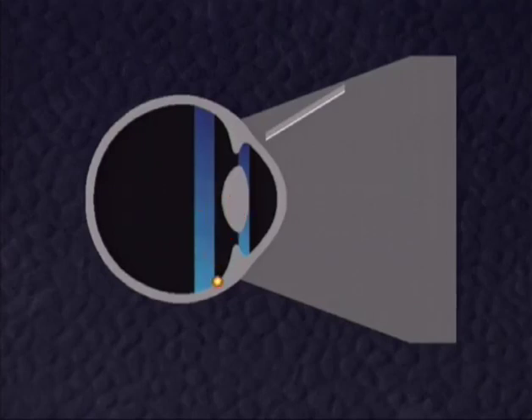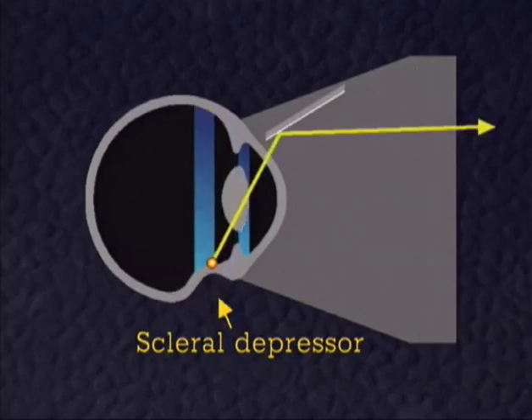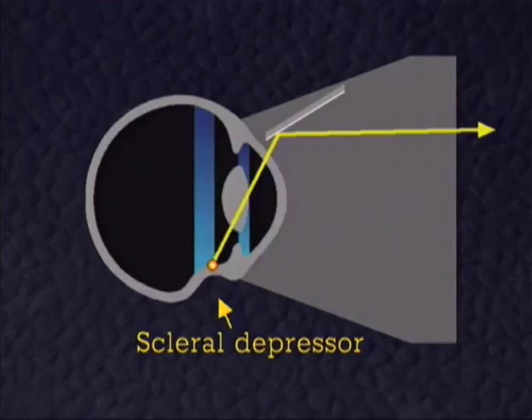No. There are conditions under which the periphery can be seen: when either the lens position has changed, or when the position of the fundus periphery has changed. In a normal eye, a scleral depressor can be used, which displaces the peripheral sclera towards the center of the globe, and thus into the visible blue zone demonstrated by this animation. As shown at high magnification by this displacement, the angle between the ray and the anterior lens surface increases, becoming higher than the critical angle, and thus the ray can pass. Therefore, scleral depression permits rays from the outermost periphery to leave the eye.